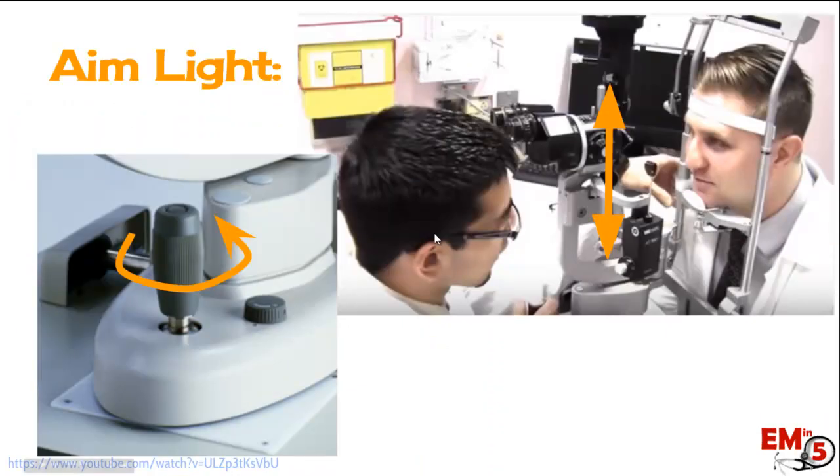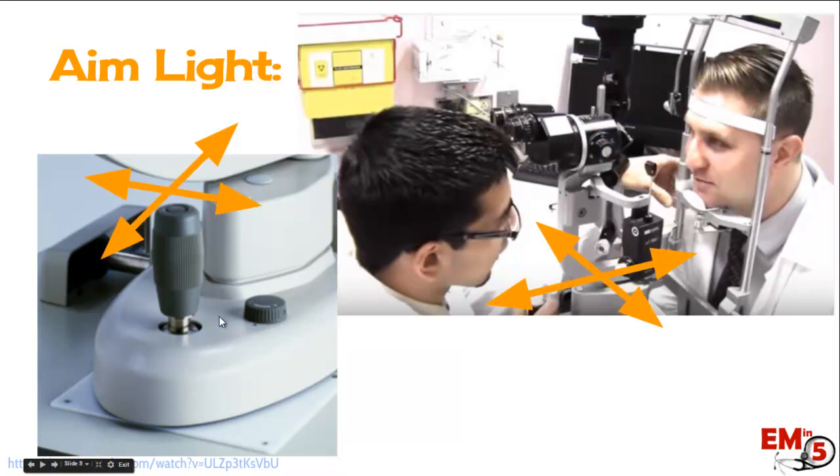Next, we have to aim the light. To move the light up and down, dial the joystick either counterclockwise or clockwise. To move it front and back, you can either move the whole machine base or, for fine adjustment, just move the joystick back and forth. The same applies to moving it side to side. You move the base forward and backward to focus on different parts of the eye — for example, to look at the lashes and lids, move the machine a little further back, then gradually move it closer to the patient to focus on parts further from you.